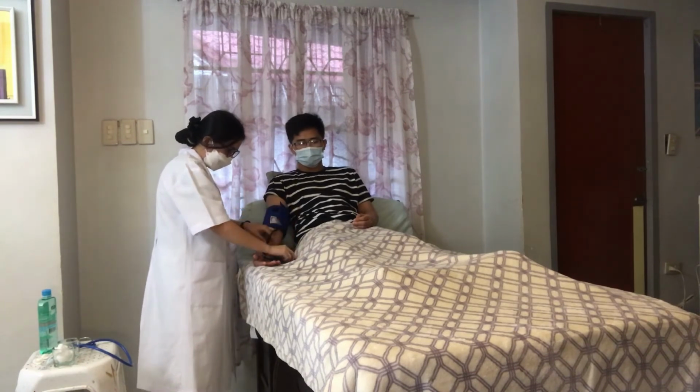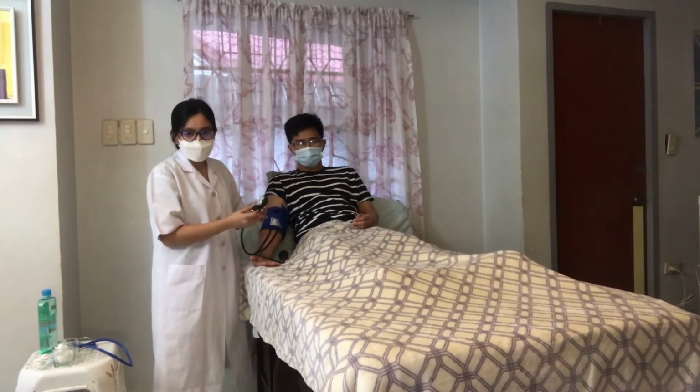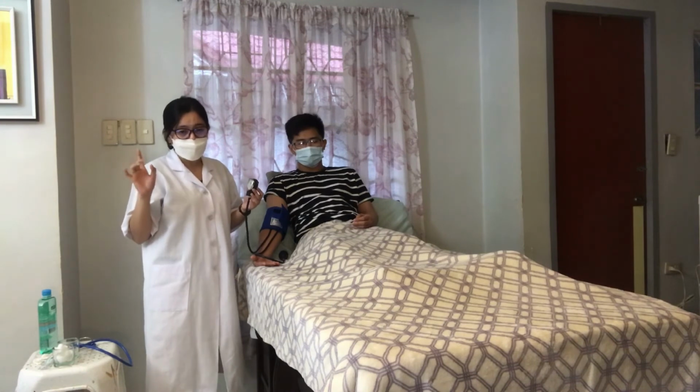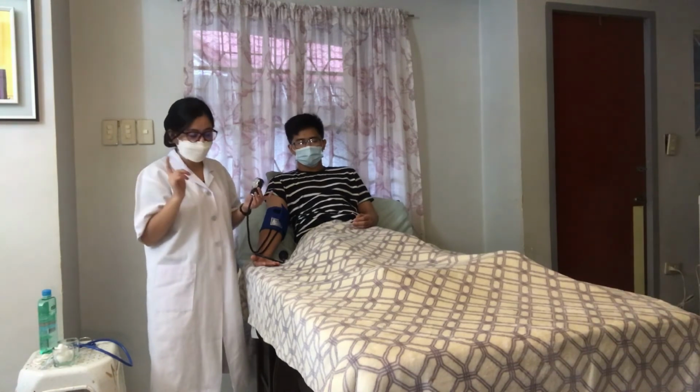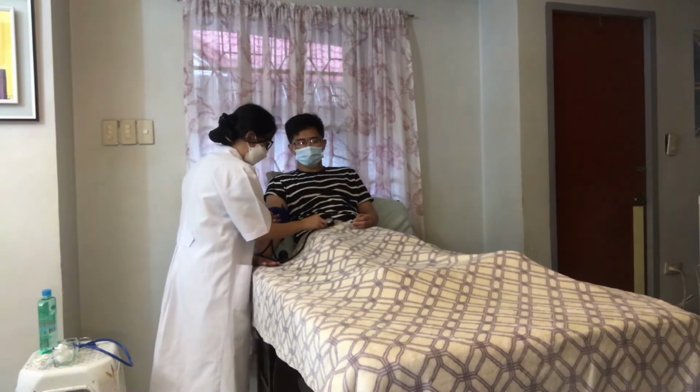Now after this, we are going to position the manometer vertically at eye level. Observation should not be farther than 1 meter or approximately 1 yard away. You have to place it perpendicular to your view.